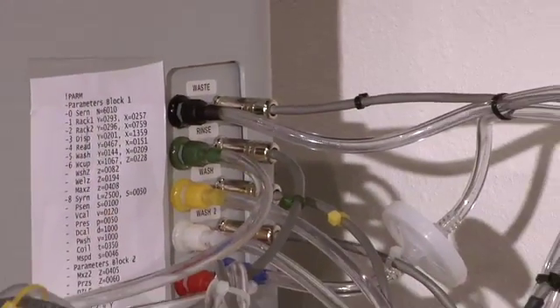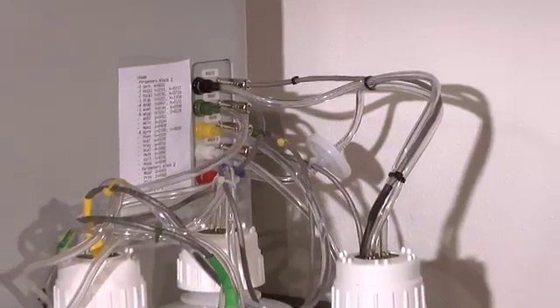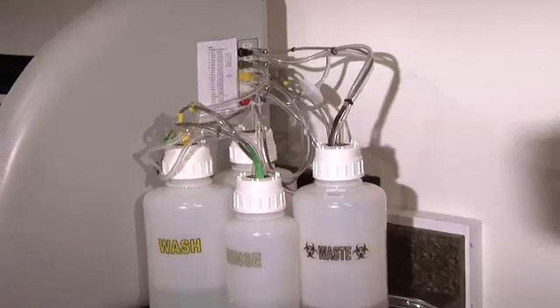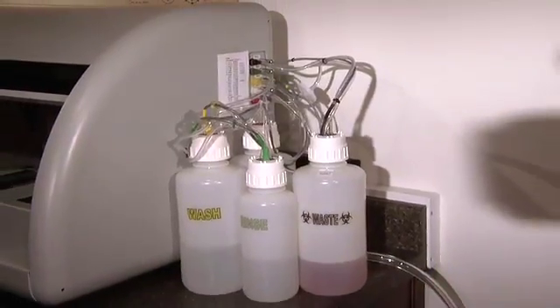Located outside of the Astoria discrete are easily accessible bottles for wash, rinse and waste. These bottles are pressurized to effectively move the liquids throughout the system and simplify waste disposal.